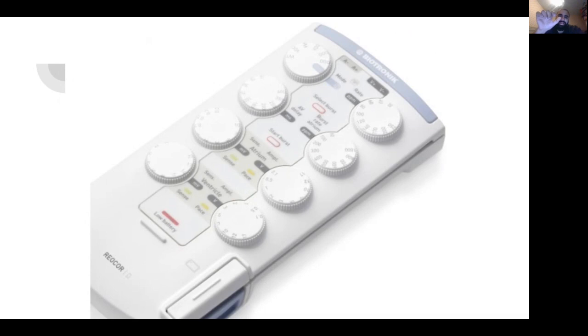So by expanding the AV delay, you give the conduction system the opportunity to start kicking in. I don't think there's any papers on it, but the theory is that will speed up the process of the heart's natural conduction pathways taking course. So that's why you may use a slightly longer AV delay.